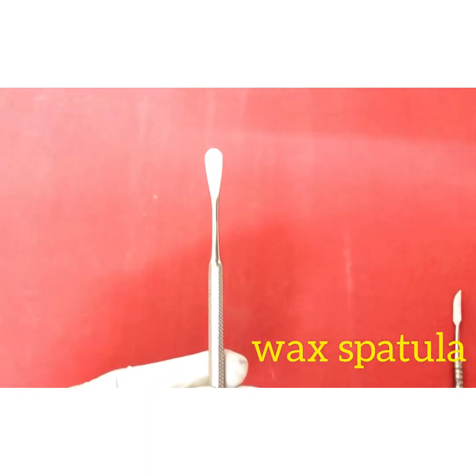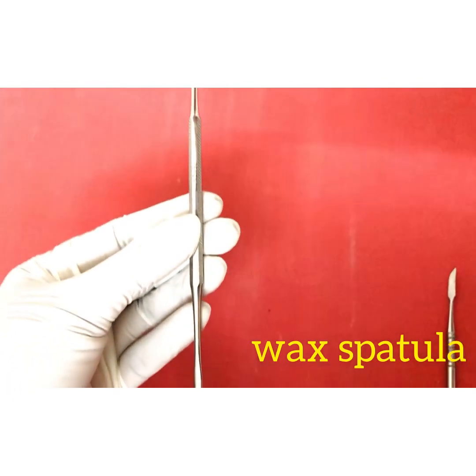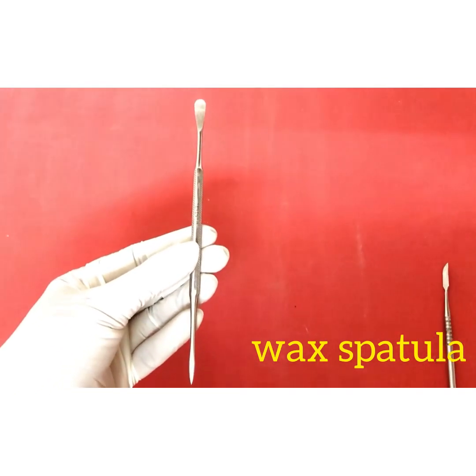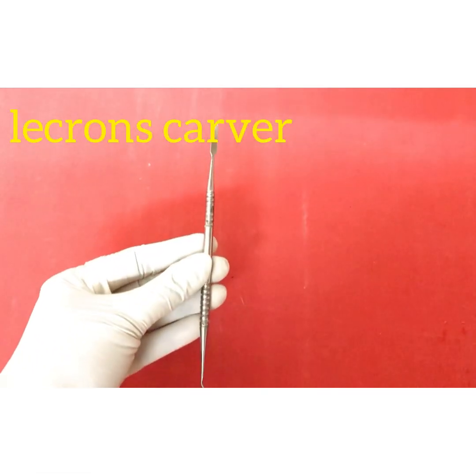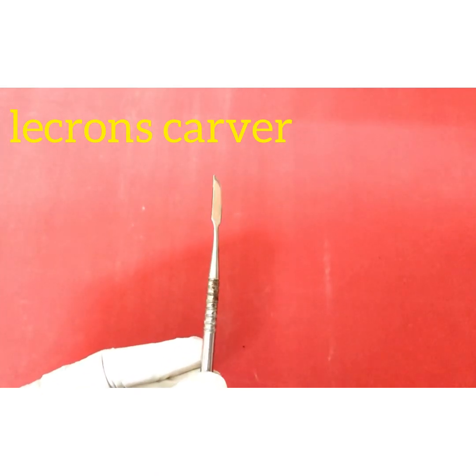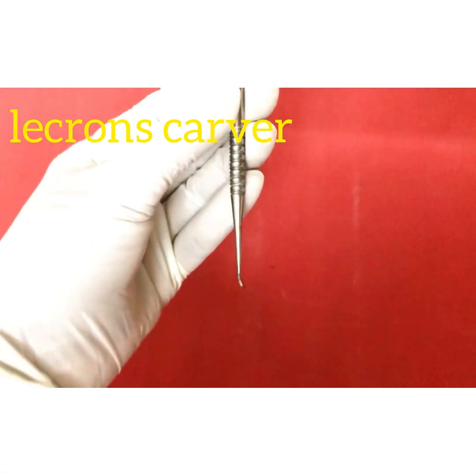This is a wax spatula — spoon-shaped on one side and sharp on the other. The spoon-shaped side is used for carrying small amounts of molten wax. This particular instrument is called the Lecron's carver, which has two edges: a small knife edge and a small spoon-shaped edge on the other. It is not supposed to be heated.